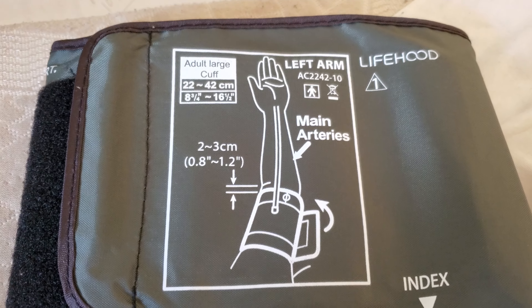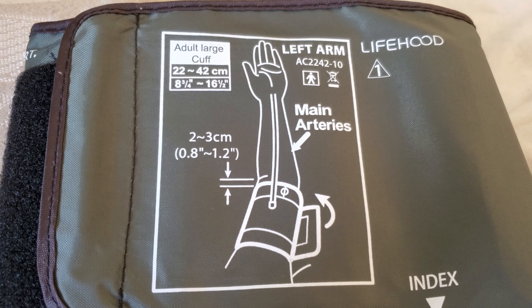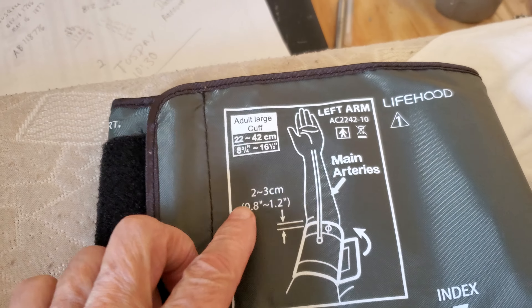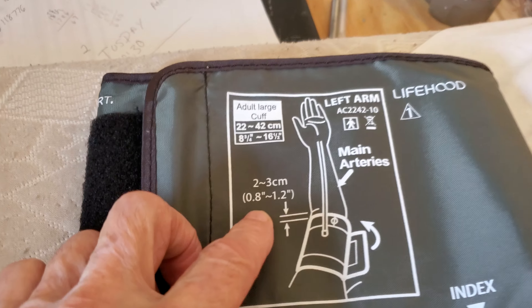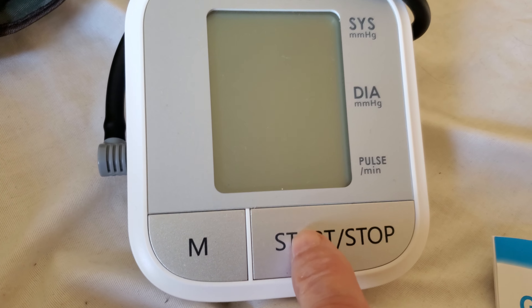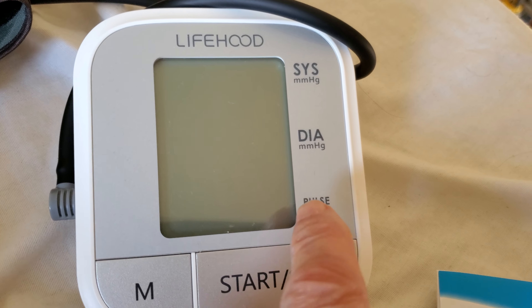This is a video of a blood pressure monitor I bought on Amazon for $24.99 — price probably went up since. I gave it a good review anyway. Here's the cuff, it's a big one. Here's how it's supposed to be put on, and then there's this stop and start button, and it has a memory.